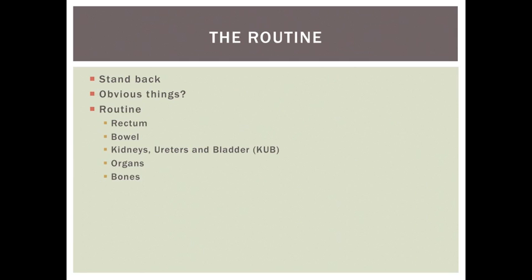I would suggest then that you go through your routine. I tend to work backwards and start with looking to see if there is any gas in the rectum, then work proximally around where I would expect to see large bowel and then small bowel. Then I look for a shadow where the kidneys should be and trace down the ureters to the bladder, before looking for the upper abdominal organs and finally looking at the bones that are visible.